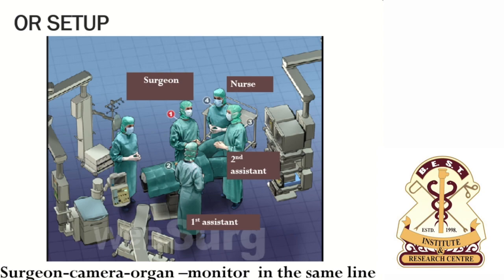Generally, time is not to be considered in any surgery. It is the outcome, better outcome, that is important. It's not just the time. Just because you are doing it in 15 minutes doesn't mean you are doing it the right way. But generally, over a period of time, the amount of time you take to do a laparoscopic surgery will almost be equivalent to open surgery, or you will even be able to do lap surgery in a much shorter time.